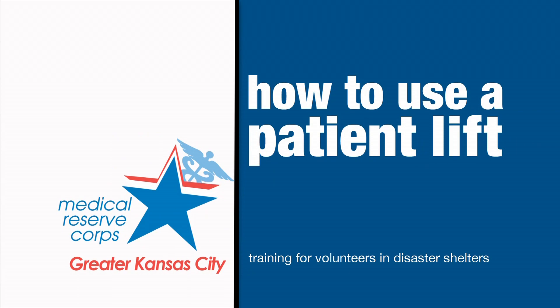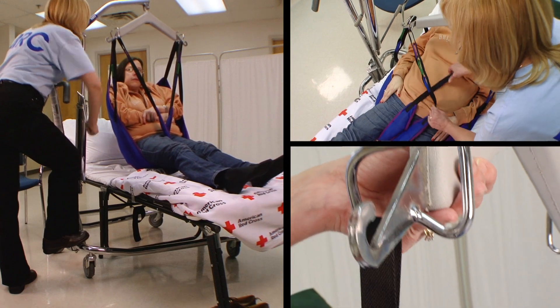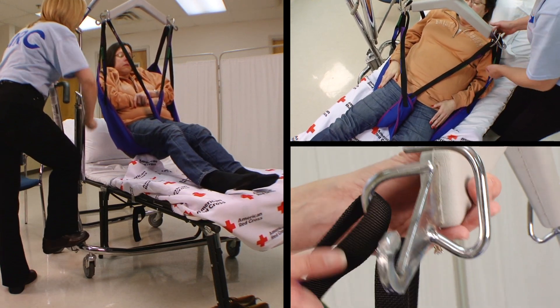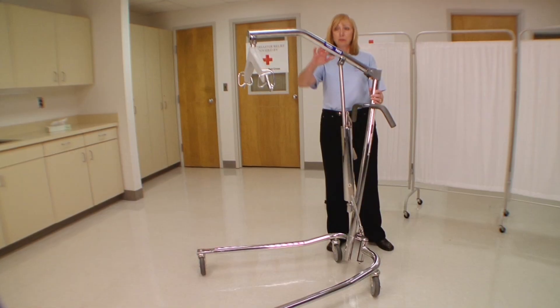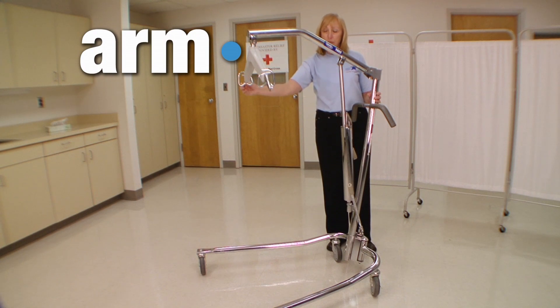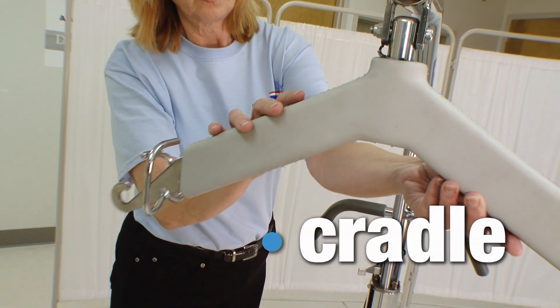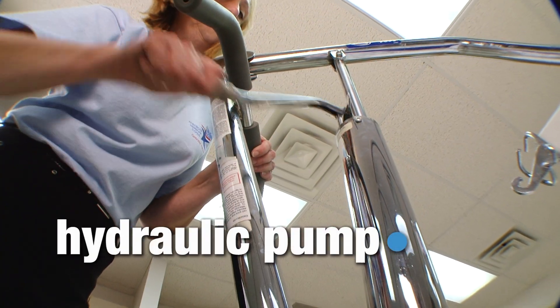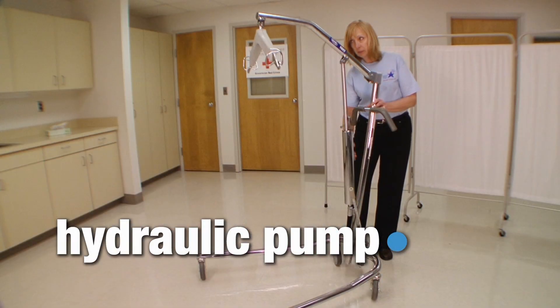A patient lifter is used to transfer individuals who are unable to assist from a bed to a chair and back to bed. At the top is the arm that supports the cradle — the sling will loop onto this cradle. This is the hydraulic pump, which will allow you to elevate the individual.